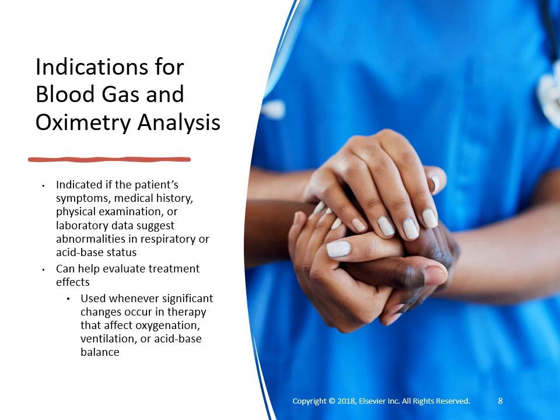Blood oxygenation can be assessed by either arterial blood gas, ABG, analysis, pulse oximetry, transcutaneous monitoring, which is used mainly in infants and children, or hemooximetry. Ventilation can be assessed by ABGs, TcPCO2, or capnography. An ABG is required for accurate assessment of acid-base status.